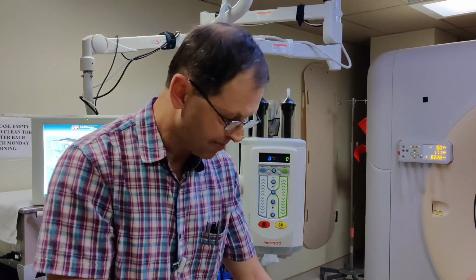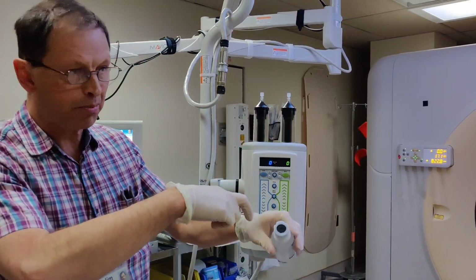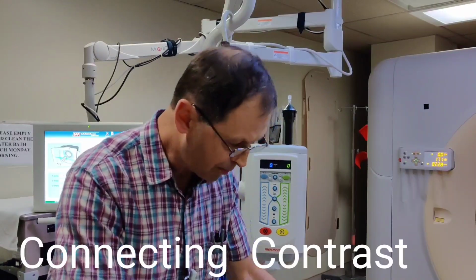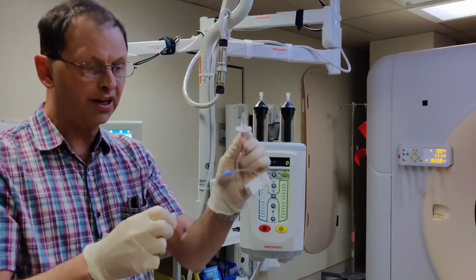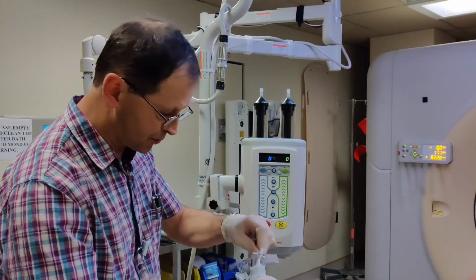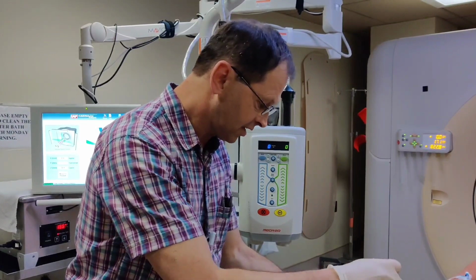So in this case, I'm going to take the syringe, pop the cap off. Now be careful not to touch the rubber stopper at the top. It's sterile. Likewise, when we connect this, the end of the spike is also sterile. So when we remove the cap, we need to be very careful not to contaminate that. So again, I'm just going to insert that all the way in. I'll remove the little tie here.